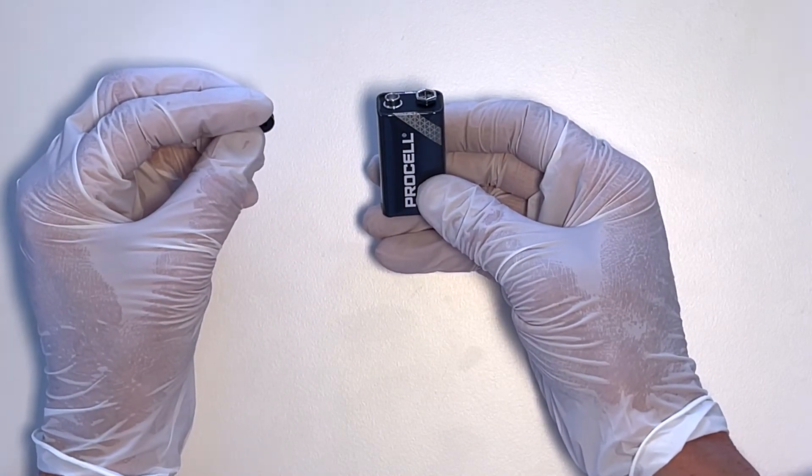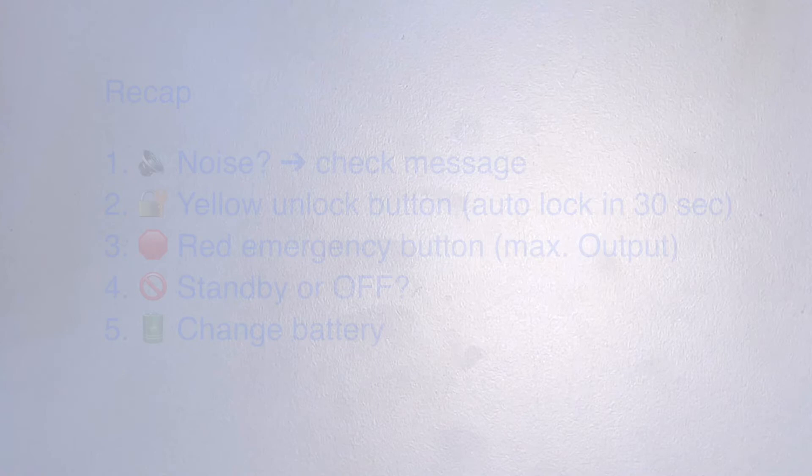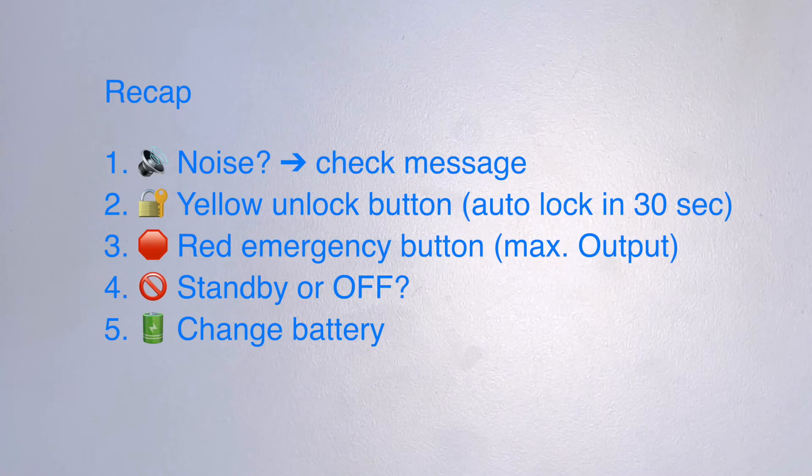So, there are five things you really need to know about this device: if it makes a noise, there is a message; press the yellow button to unlock it, and if you don't do anything for 30 seconds it will lock automatically; the red button is an emergency button to give maximum output in an emergency situation; how to turn it off by pressing the OFF button and choosing STANDBY or OFF; and fifth, how to change the battery.